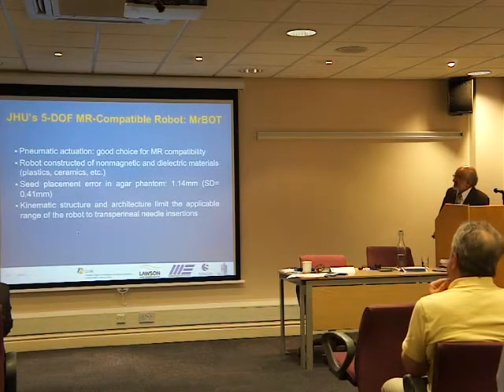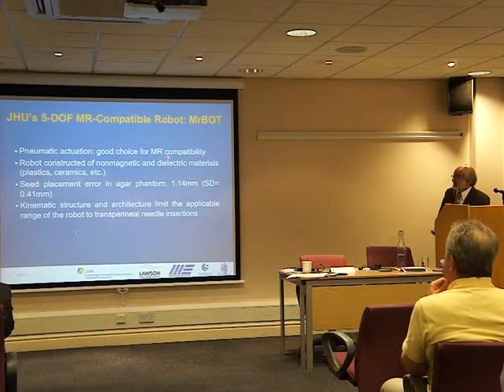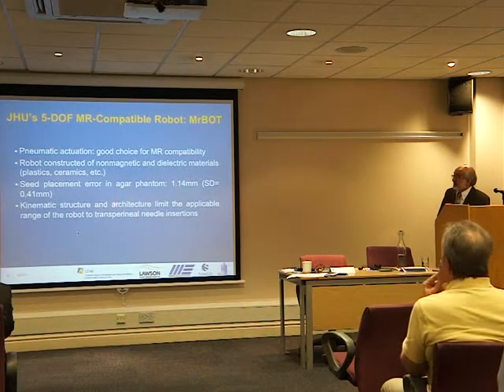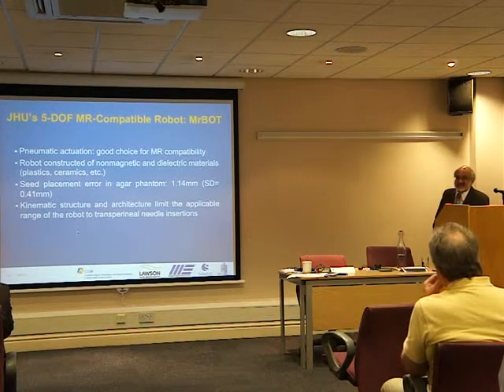There has been some work done in MR-compatible systems. The advantage of this is that you can get higher accuracy, and if it's MR guided, you can also get much better control, much better visibility of the prostate. This has been tested at Brigham and Women's Hospital in Boston. They have an intraoperative MR suite where they can actually do this in real time. So they have intraoperative real-time MR imaging to guide the needle. There are very few ORs that are equipped in this way.